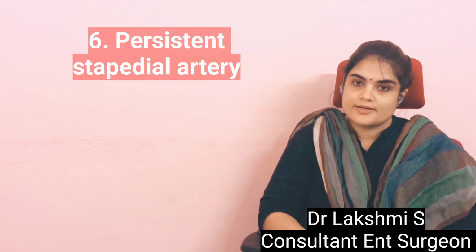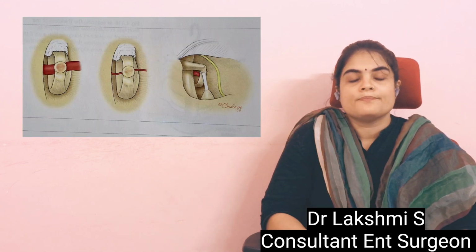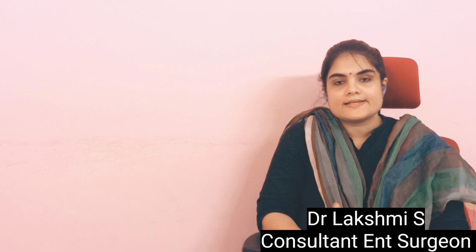Another thing that can be encountered is a persistent stapedial artery. It is an embryological remnant. Usually this persistent stapedial artery can be cauterized with bipolar cautery. Usually it is present in the anterior part, so you can do a fenestration in the posterior part of the footplate. Another problem is malleus ankylosis.